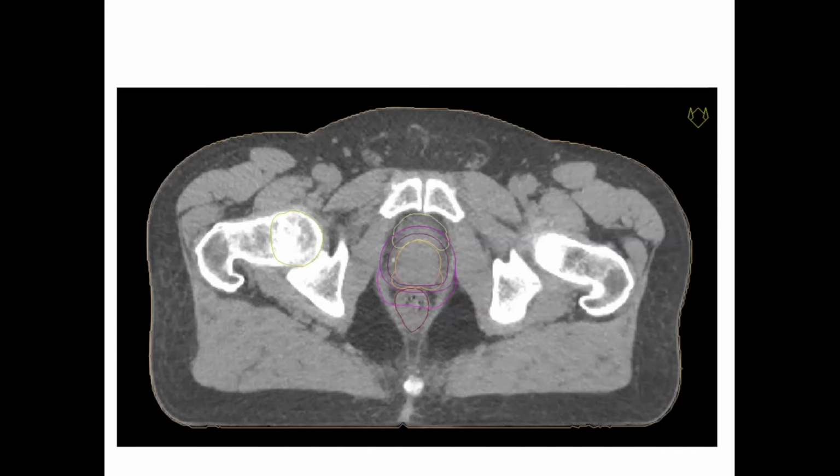And that's part of the benefit and the gains that you get from brachytherapy, because in brachytherapy, you're sticking the radioactive straight into the prostate. You're not having to come through the skin, through the muscle. I mean, you can see on this image how much there is to get through, from the skin surface, through the fat here, through the muscle, through the bone, all the way down to the center, to the prostate. And this particular image is in the lower part of the pelvis where there's no bowel or bladder visible.